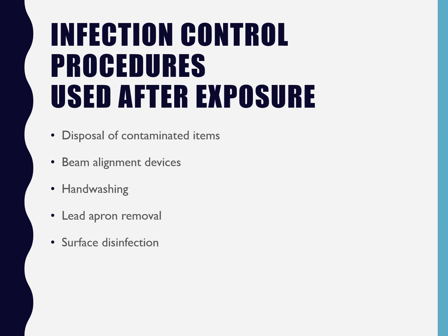All right. It feels like the during exposure was way less than the before. But anyway, now we're done, right? We've finished taking our radiographs. Our dentist has looked at our radiographs, and they have decided that we don't need to take any retakes. We've got everything we need. For the purpose of my class, you're not going to have any retakes anyway. So I'm going to look at your radiographs, and I'm going to say, okay, you're good. Go ahead and print those out.